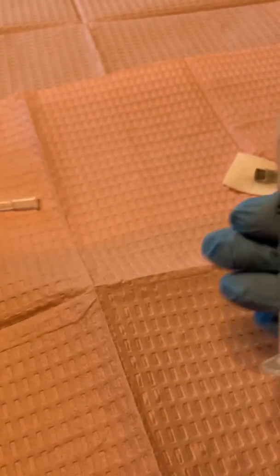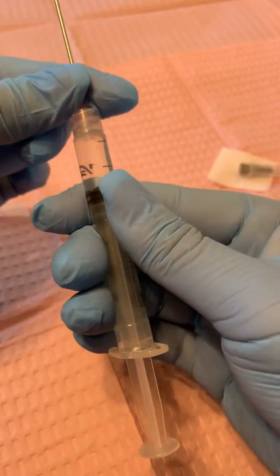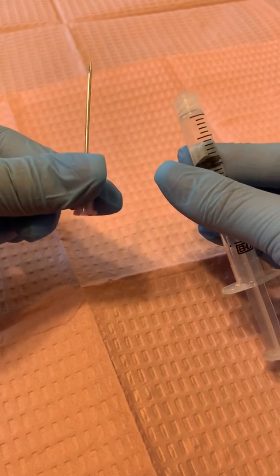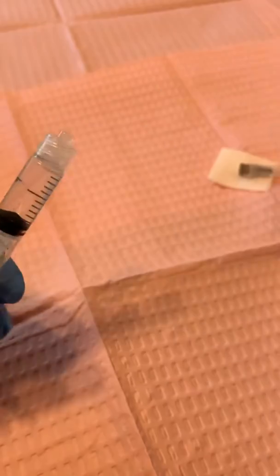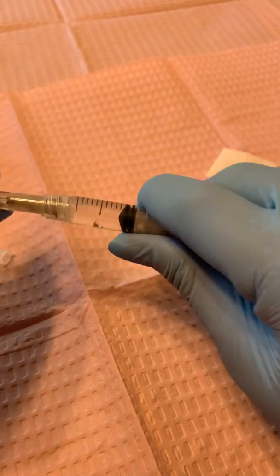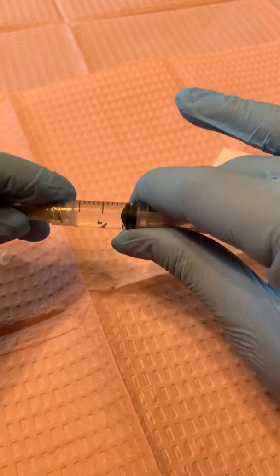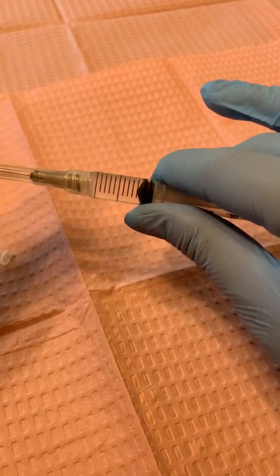We are going to exchange the needle. I'm going to take this needle off by twisting it — lefty loosey — and I'll dispose of this into the sharps container. Don't set it down because I don't want to contaminate. I'm going to grab the other needle that I set down on the alcohol pad, which has not been contaminated, and luer lock this one into place. Nice and tight because this is the one I'm actually going to administer the injection with — you want it nice and tight so that liquid doesn't come out and the hub doesn't accidentally come off.